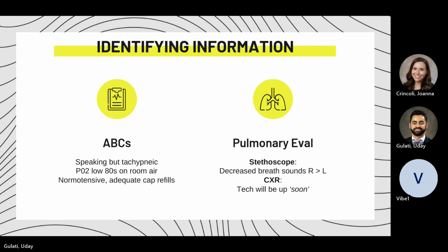And then you say, okay, let me get a chest x-ray. And you obviously hear the response, okay, I'll go ahead and put the order in. And then you say, no, go ahead and please call. And then you hear, okay, I'll go ahead and call. And the chest x-ray tech says, I'll be up soon. Meanwhile, you don't have a diagnosis. You don't know what's going on.